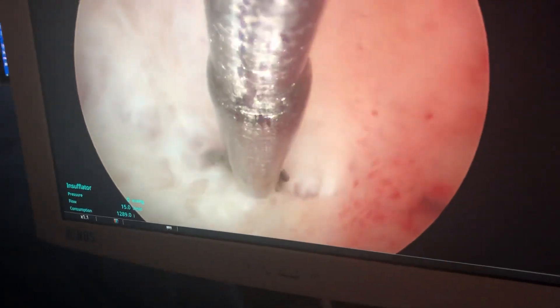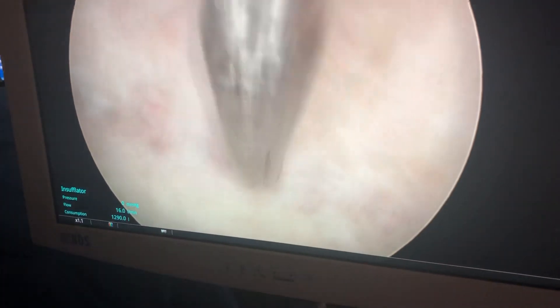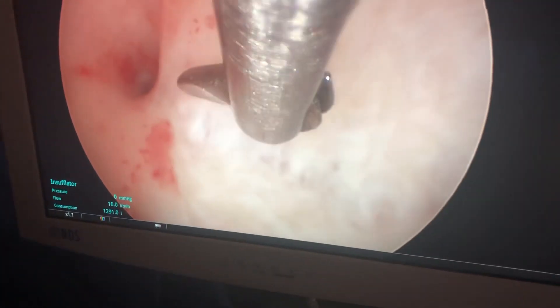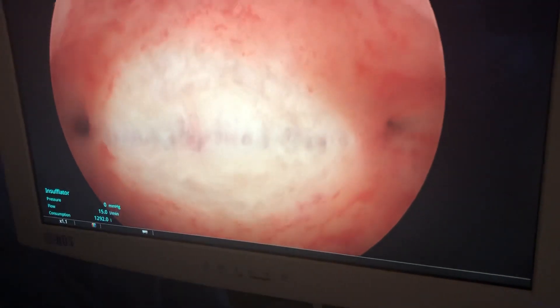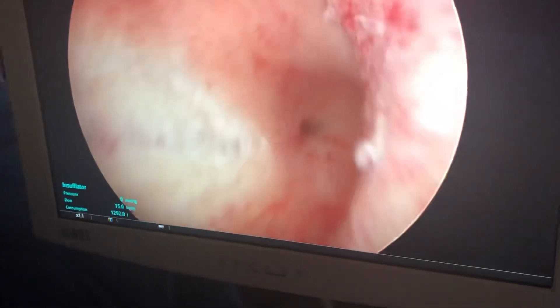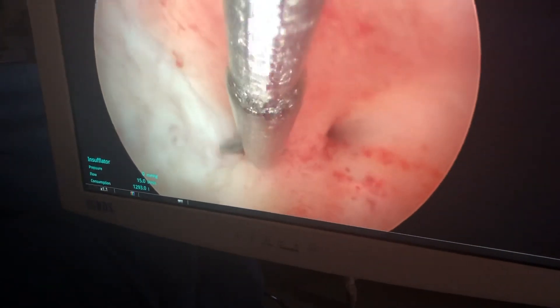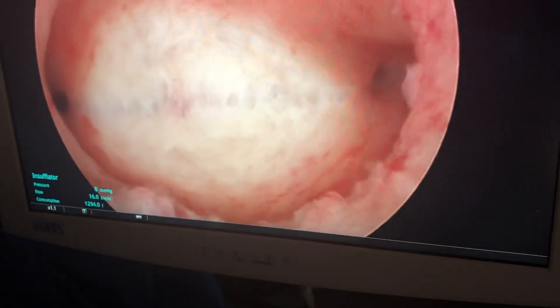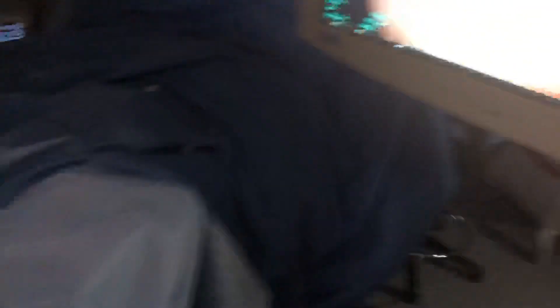So you can see there's absolutely no bleeding. The top of the uterus is now starting to turn pink, which is telling us we're pretty much finished here. And if we back off, you can see there's the septum — all gone. The top of the uterus is now a normal shape, more triangular shape. We don't want to get too close to the tube there. But right there is a beautifully resected septum. The inside of the uterus now has a normal shape. That is resection of the uterine septum.